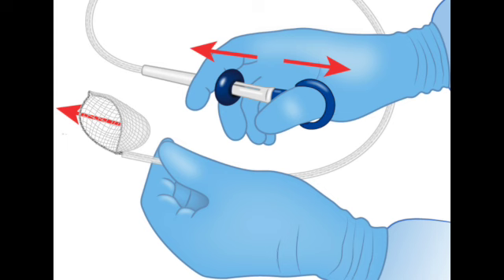Yeah. Mechanically, it works a bit like other tools you insert, like biopsy forceps or maybe a cytology brush. But the way you handle it, the ergonomics, that's really important. Typically, the operator uses their right hand, thumb goes in the handle ring, and then the index and middle fingers control the slider mechanism.